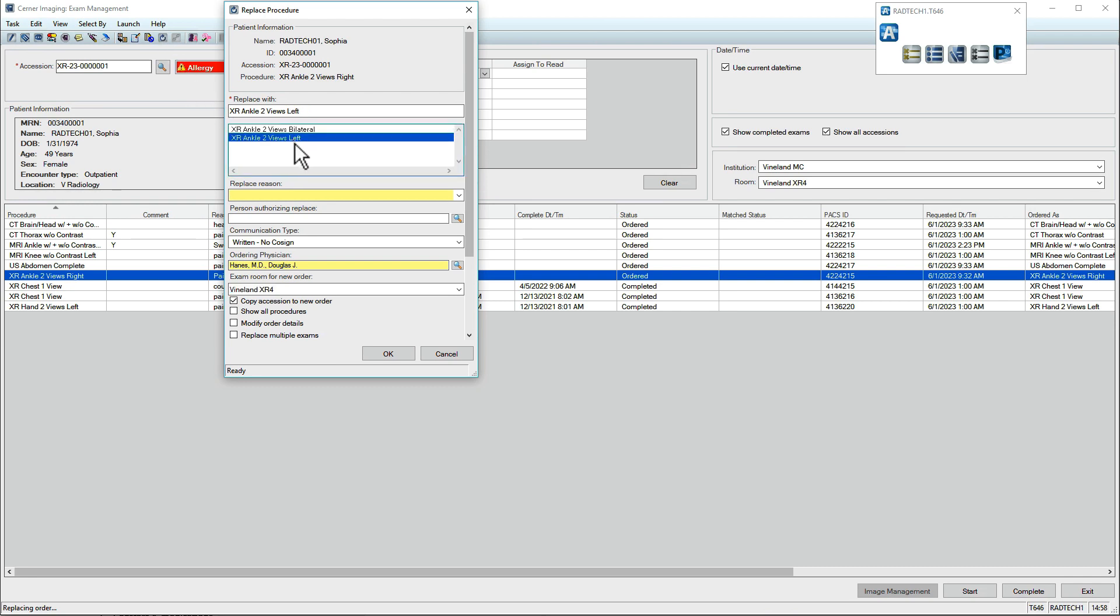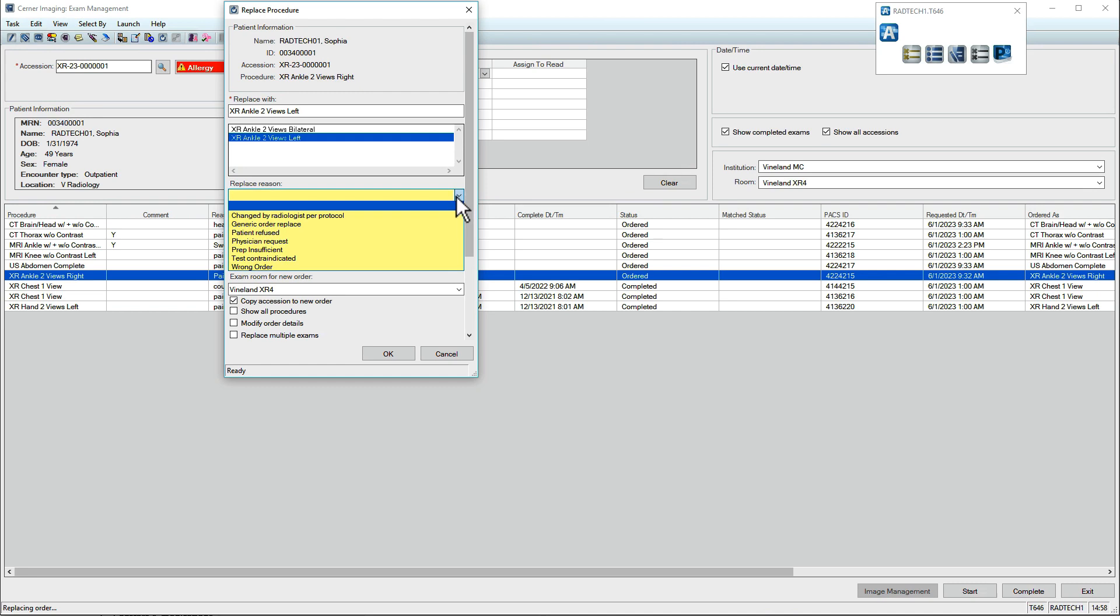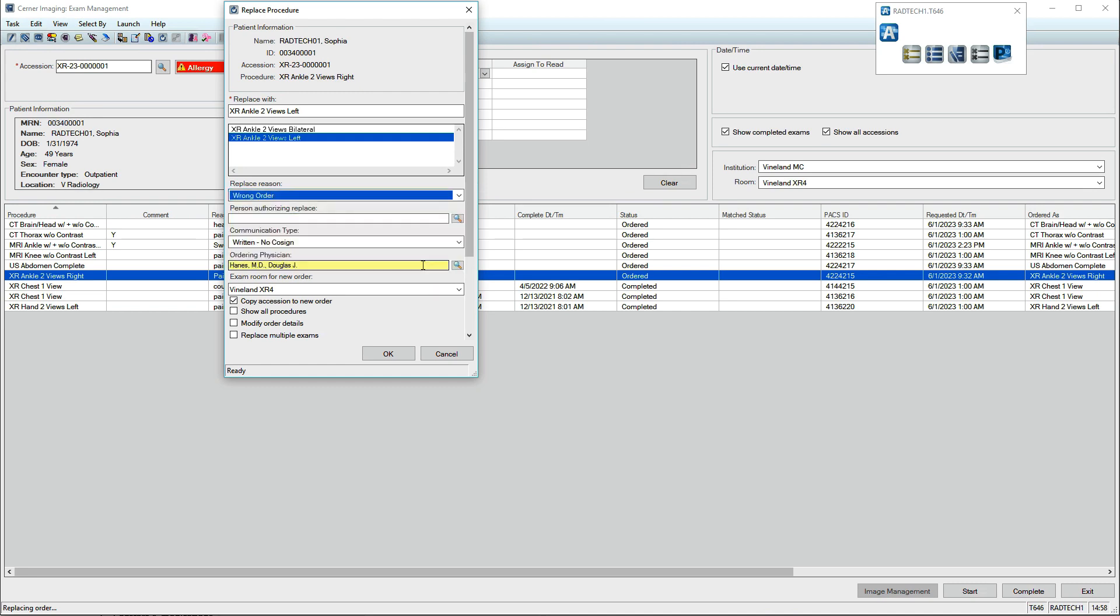If the patient requires a different exam type or a scan of a different body part, a new order must be placed. When all details are entered, click OK.